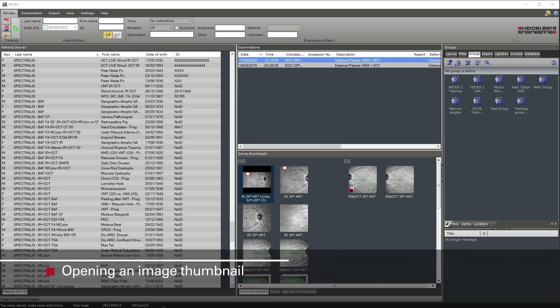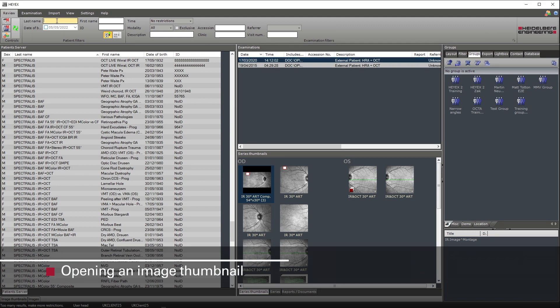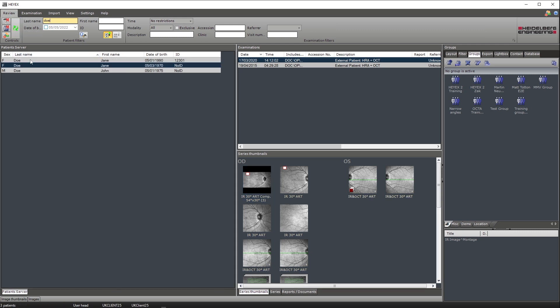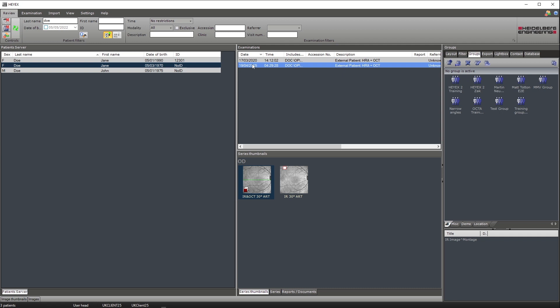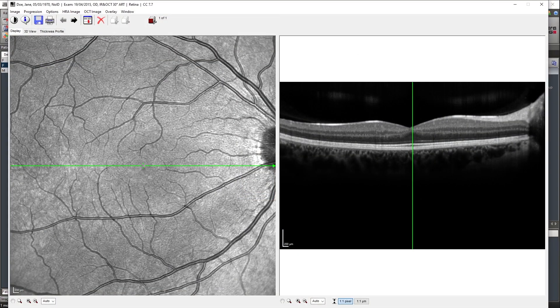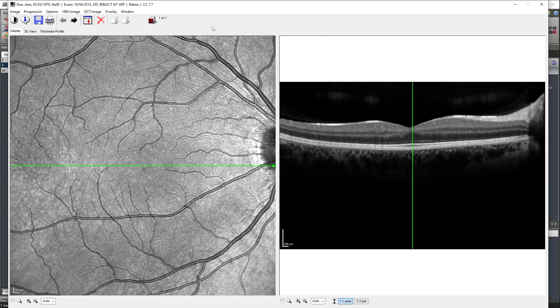To open a patient's scan, select the patient required within the patient server, then select the examination date you wish to review. Once selected, double click on the thumbnail of the scan you wish to review. Once double clicked, the scan will open in the reviewing software.